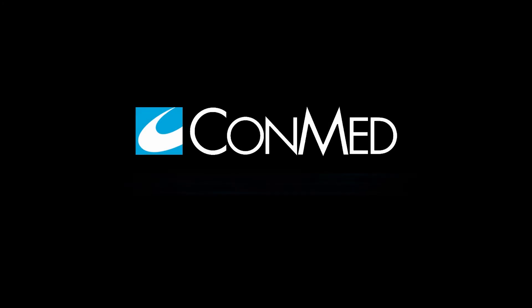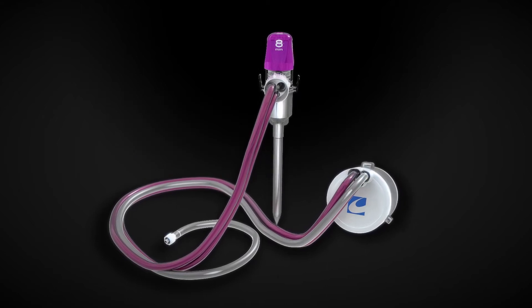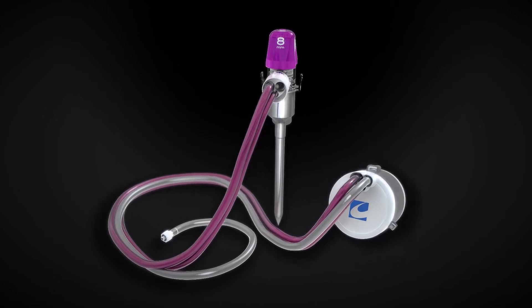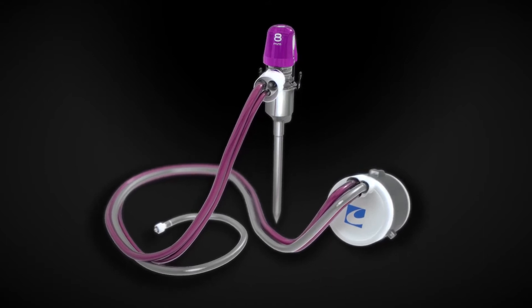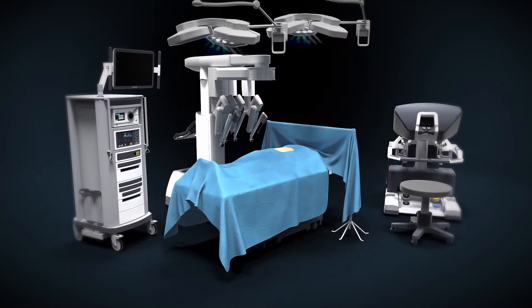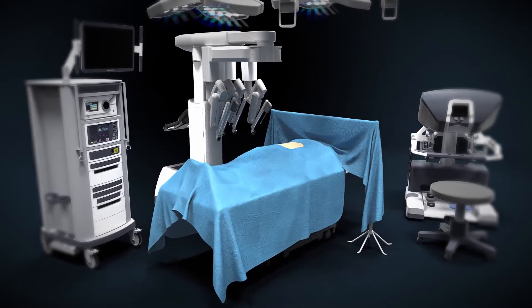ConMed is pleased to introduce the AirSeal robotic solution. By integrating the AirSeal technology into a proprietary cap for the da Vinci cannulas, this solution allows robotic surgeons to operate with the benefits of AirSeal without requiring the need for an accessory port.